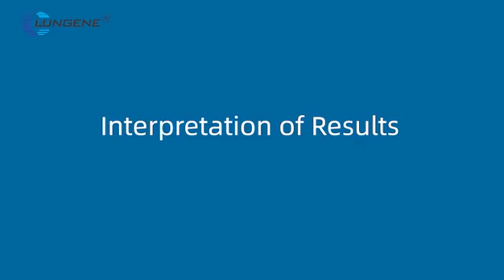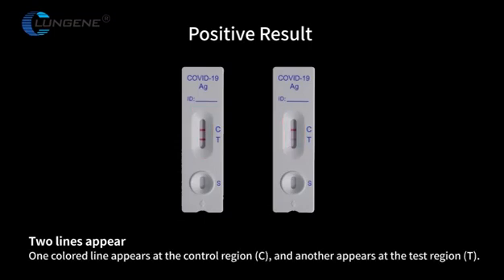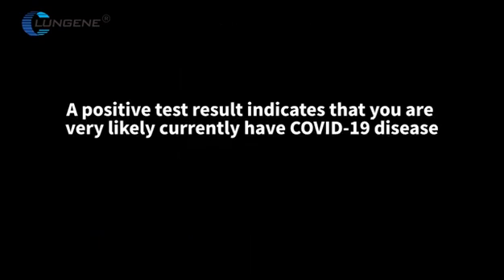Positive result: Two lines appear. One color line appears at the control region C, and another appears at the test region T. Please look very closely — the T line can be very faint. Any color line visible at T is positive. A positive test result indicates that you are very likely currently infected with COVID-19 disease.